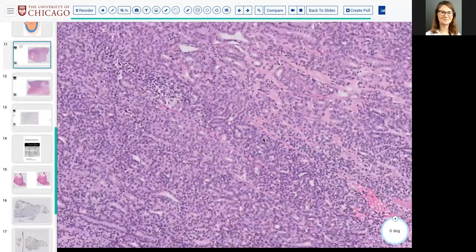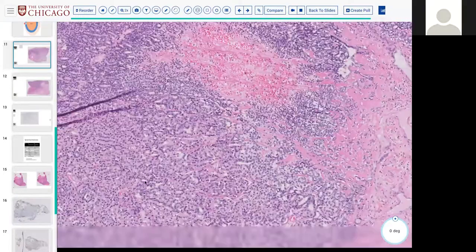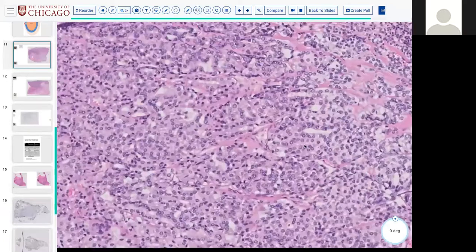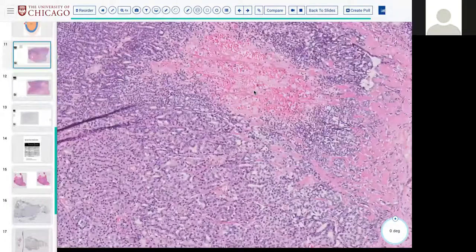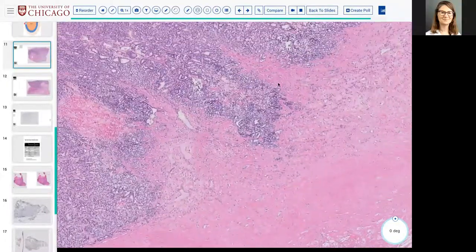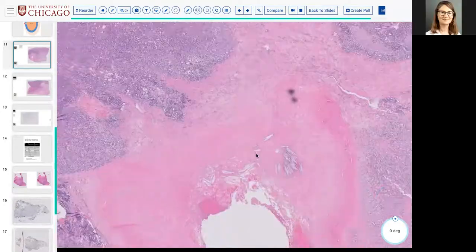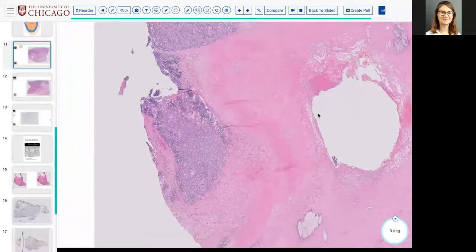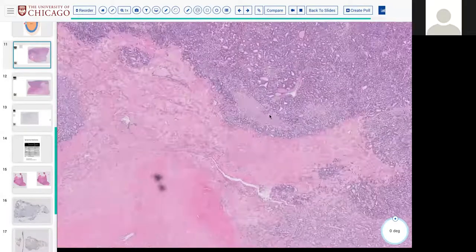Yeah. Good. I'm not sure if this is necrosis here, or just... You certainly should think about it. All right. We'll keep looking. Yes. And extensive fibrosis here. But it could be the site of prior FNA. But I believe it's invasive.